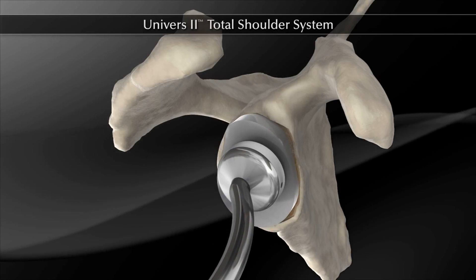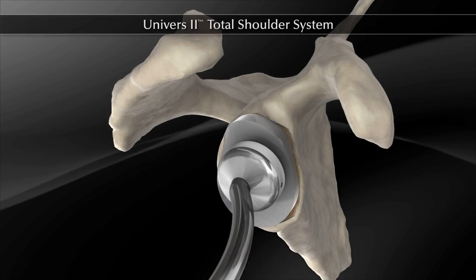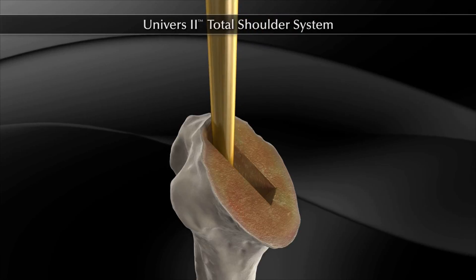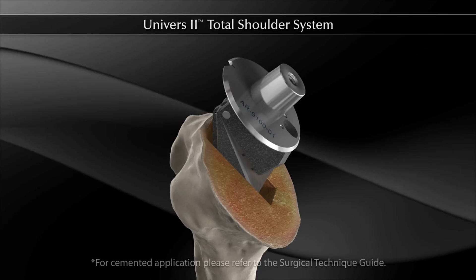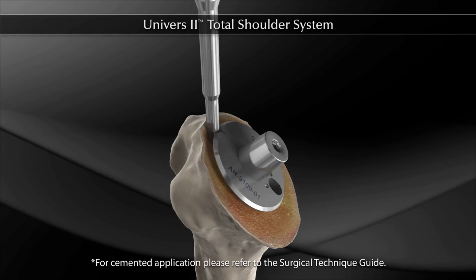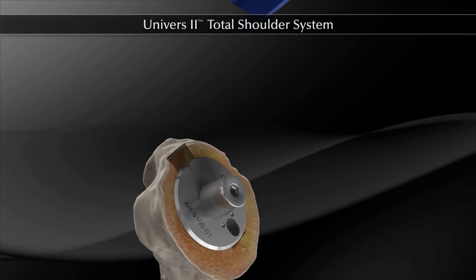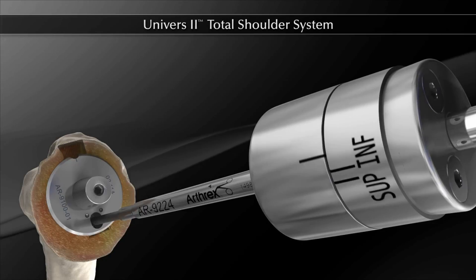The keel of the implant is pushed into the cemented glenoid vault and impacted. The glenoid component is held firmly in place until the cement has cured. Once the glenoid portion of the procedure is finished, attention is redirected back to humeral stem implantation. The resection protector and trial stem are removed. The appropriate size humeral stem is opened and placed in the prepared canal. The stem is impacted until the trunnion contacts the humeral surface and is fully seated. The inferior locking screw on the medial portion of the trunnion is tightened by visually confirming the INF mark is rotated past the indicator line on the torque driver.